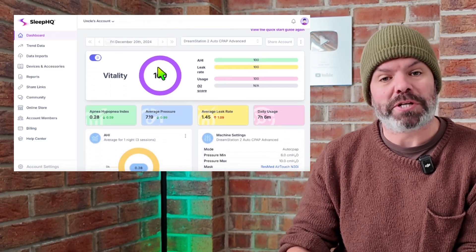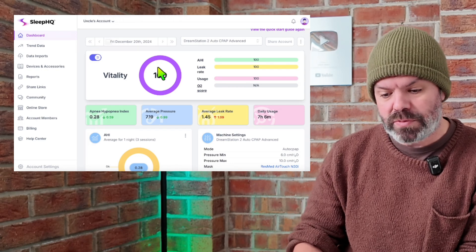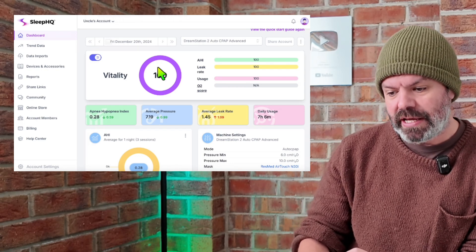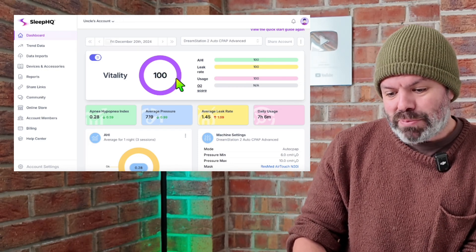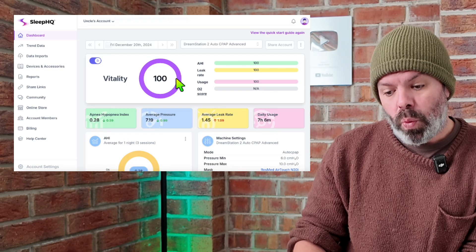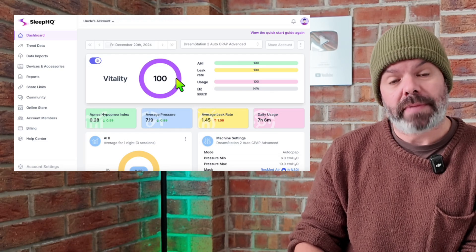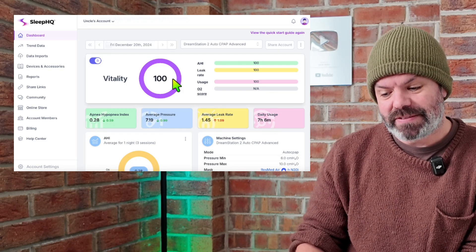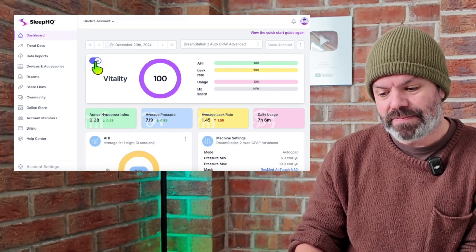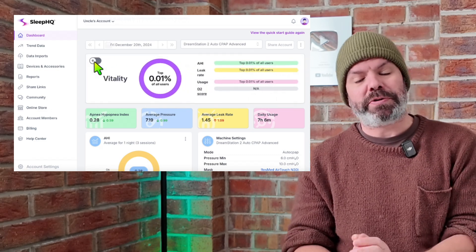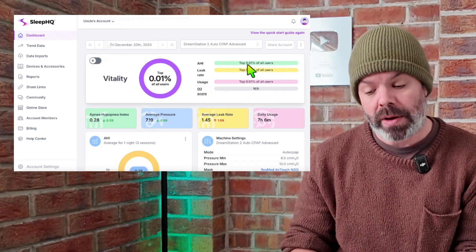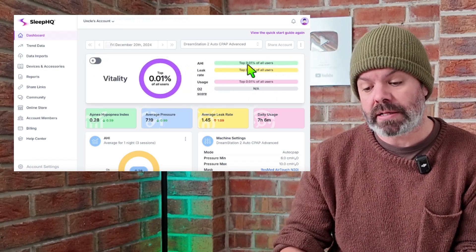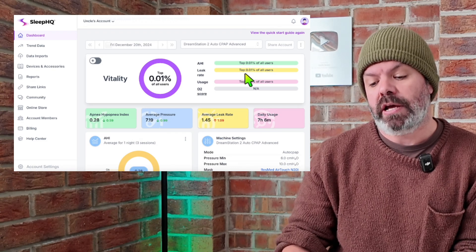You can compare your results against other people on the platform. So you can see here this patient got a perfect 100 out of 100. They're in the top 0.01% of users for apnea, hypopnea, index, leak and usage.